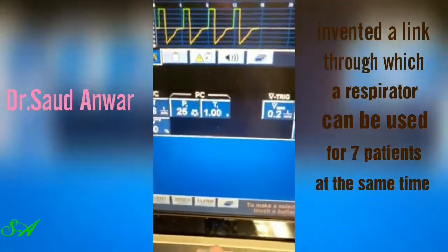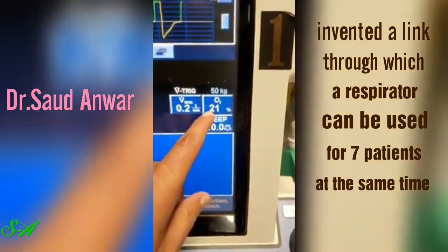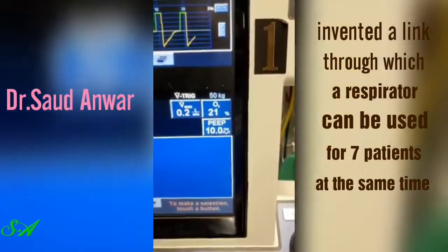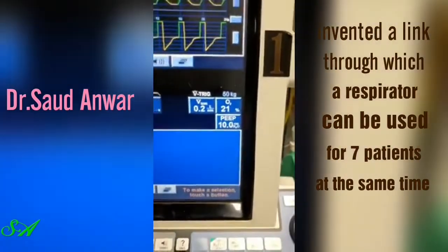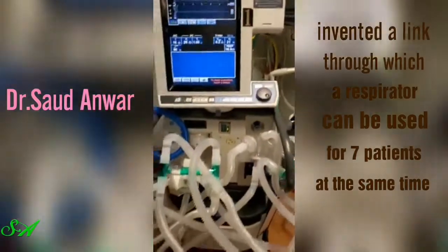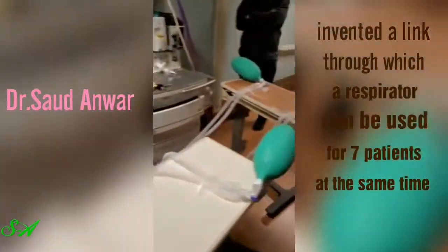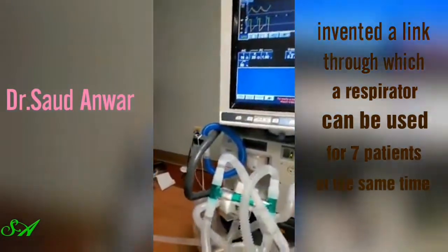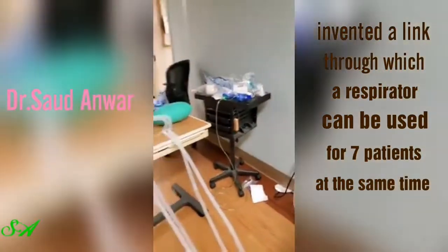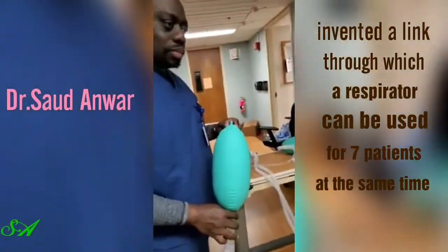So you set up an inspiratory pressure of 25, and we're using 21% oxygen because we don't want to waste the oxygen in the hospital. We put a PEEP of 10, and we can go up on the PEEP more. Each one of these patients is getting a volume based on the exact settings that we have set up, and we are using the pressure control ventilator. With this strategy, we can do ventilation for 7 at this time, but far more.